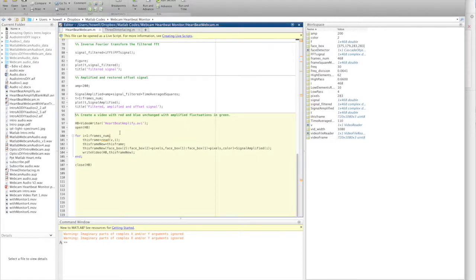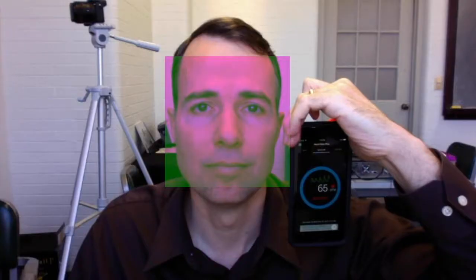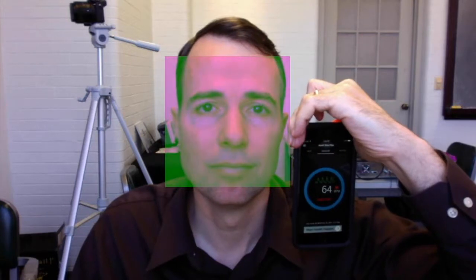Here we write a video called heartbeatamplify.avi. In this nested for loop, we go frame by frame and set the green value in the box equal to the amplified signal we just generated. We close the video. Let's run this section. Let's open the video file we just generated. It is interesting to compare the color with the heartbeat monitor signal.